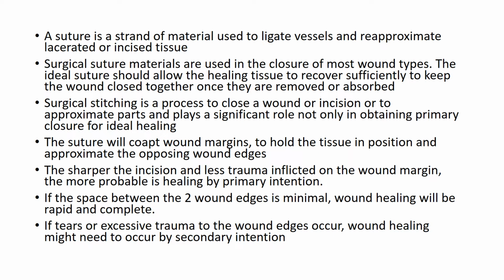The suture will coapt wound margins to hold the tissue in position and approximate the opposing wound edges. The sharper the incision and the less trauma inflicted on the wound margin, the more probable is healing by primary intention. If the space between the two wound edges is minimal, wound healing will be rapid and complete. But if tears or excessive trauma to the wound edges occur, wound healing might need to occur by secondary intention.